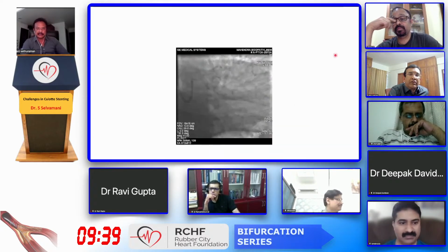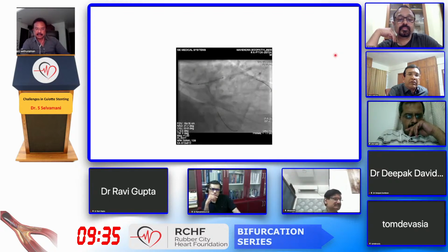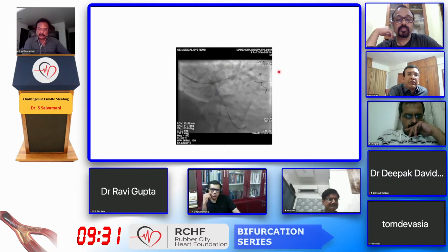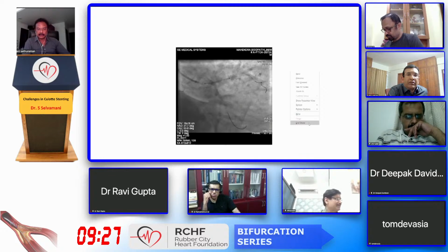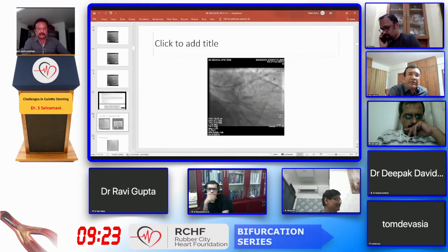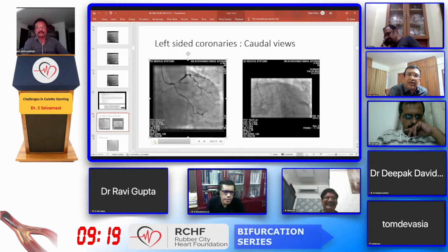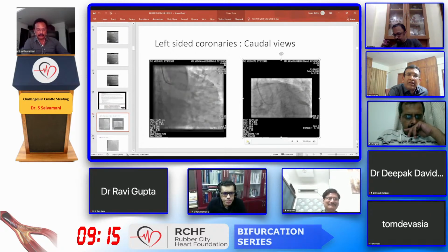See, it is something like this. For example, what happened in this case is, okay, I'll do one thing. Just wait here. Hold on. I will just try to show you what it is. Hello. This is crushing, isn't it? Mr. Mani? It is not crushing. You are not crushing. See, for example, look at this case which I have. It is actually not a culotte.